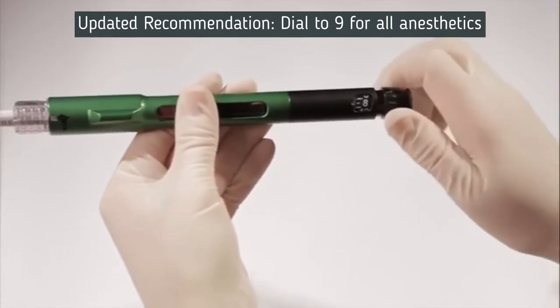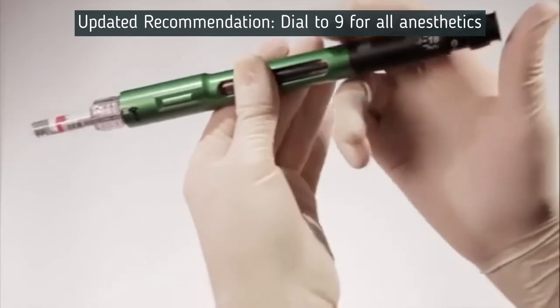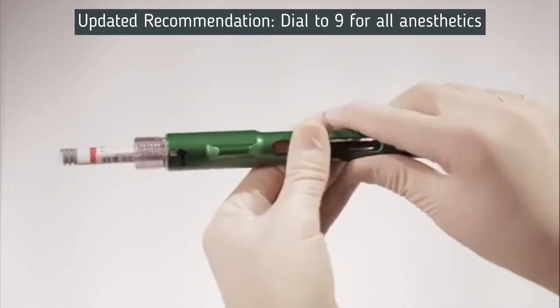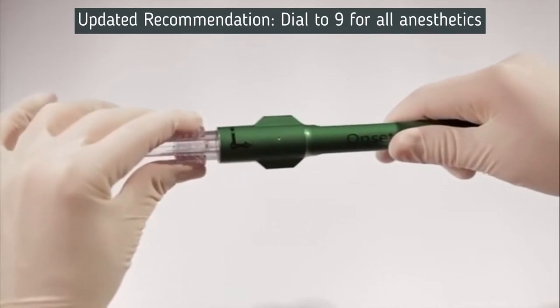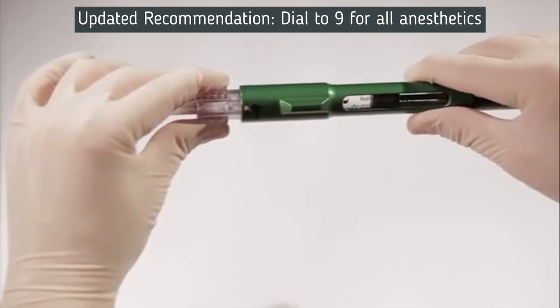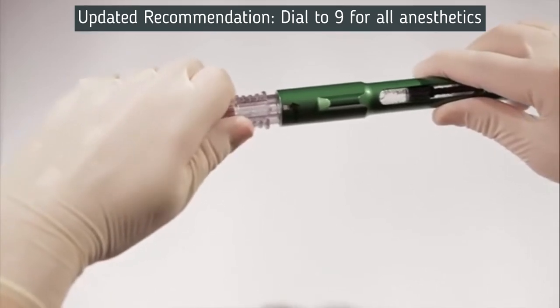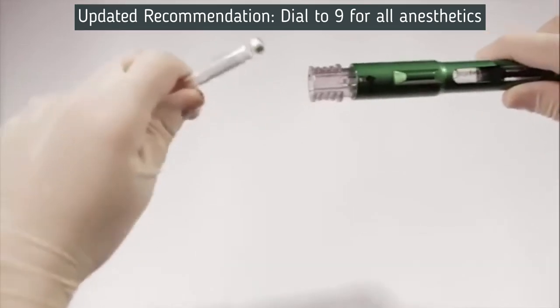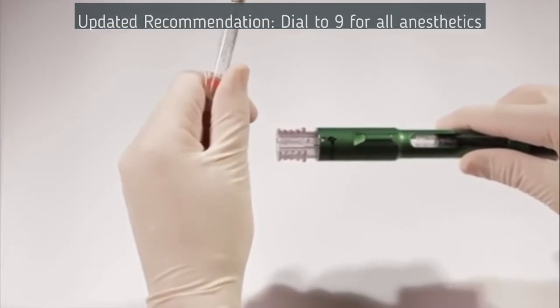Step 2: Dial the desired amount of solution to be mixed with the 1.8-milliliter cartridge and push the dispensing button. Step 3: After mixing, remove the 1.8-milliliter cartridge by grasping the connector with your thumb and forefinger. Pull the connector out to the number 2 position, then turn counter-clockwise approximately one quarter turn to the number 1 position. This will unlock the 1.8-milliliter cartridge from the connector. At position number 1, you can pull the cartridge out. Inspect the mixed cartridge to rule out bubbles, particulates, or discoloration. Use the mixed cartridge immediately.